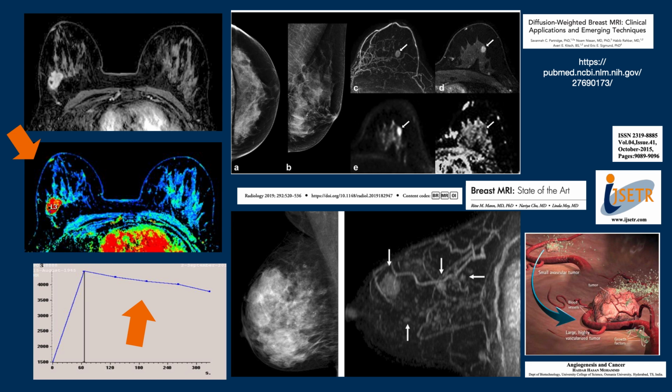This is important information for the reporter and is based on the phenomenon of neoangiogenesis. Also of interest, although used less than in prostate studies, is the diffusion, which indicates how difficult it is for water to flow in pathological tissues compared to healthy ones.